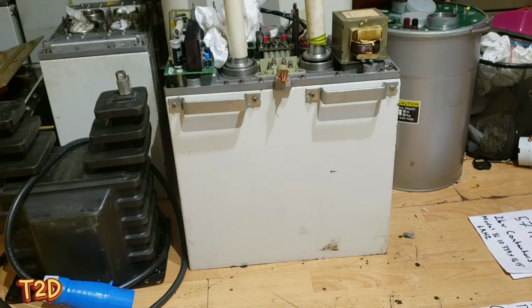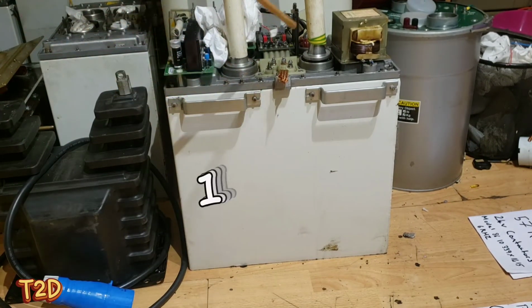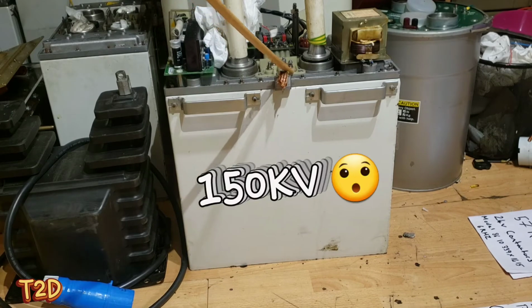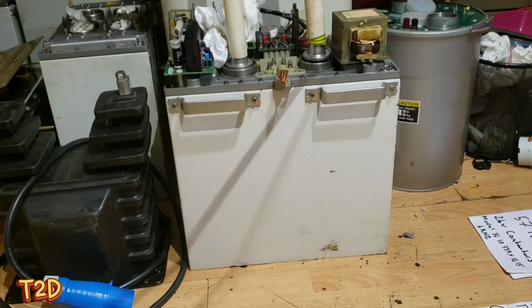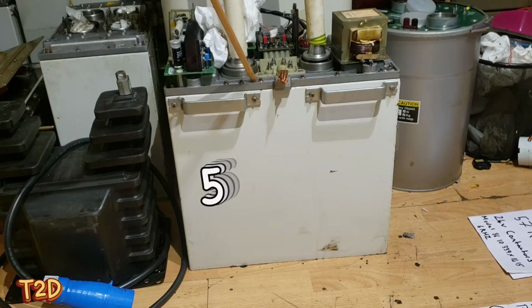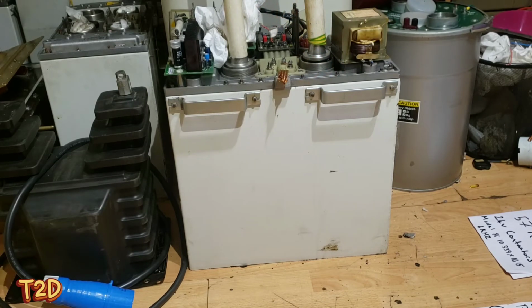Hi guys, I thought we'd take a closer look at these Siemens tanks. These are high voltage X-ray generator tanks, or as they're known in the trade, HT tanks. There's a microwave oven transformer on there for reference for the size, and these seem to be quite a popular high voltage generator, at least in the UK. So if you guys are going to come in contact with a transformer, it's probably going to be one of this type. So I thought we'd have a closer look at it.